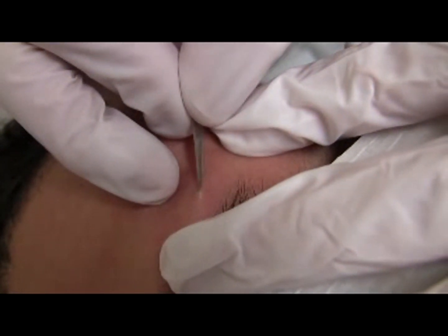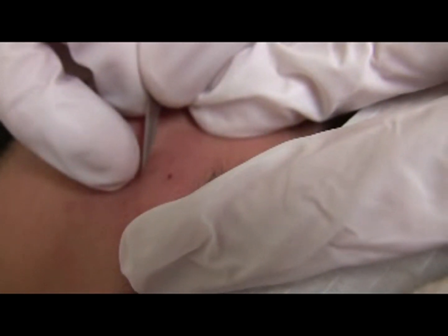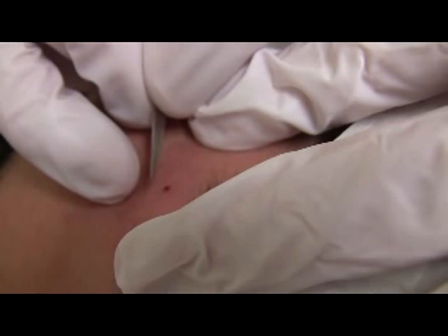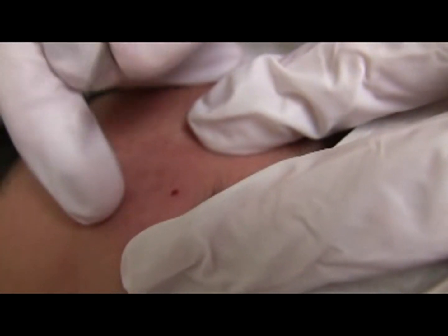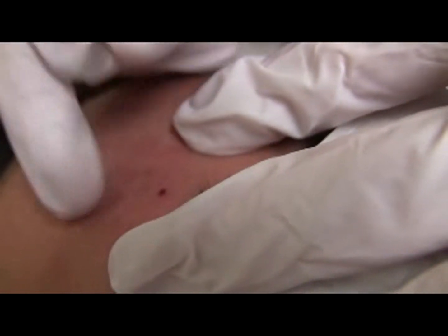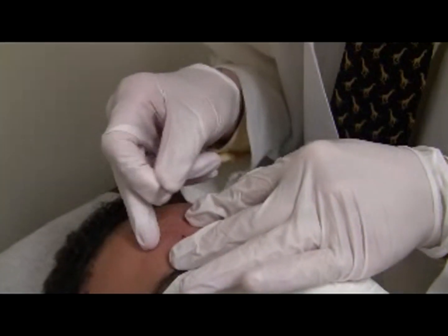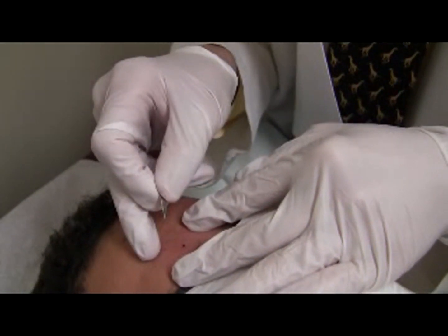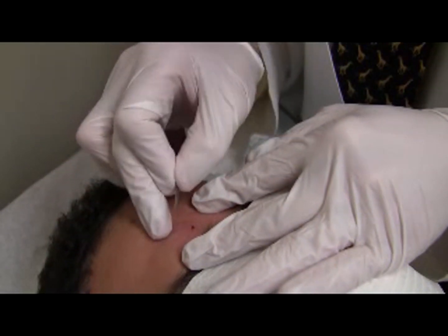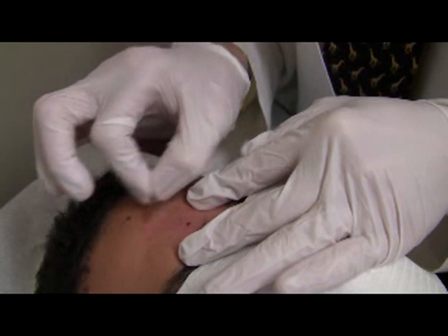I advanced it a little bit and now I'm going to pull upward. Advance the tip of the 11 blade to the center of the lesion. Be sure that your right third finger is touching the patient's skin and that your thumb puts pressure on your right index such that your right index squeezes against your right third finger. The idea is that my finger is the stabilizing point and I'm pushing my thumb towards my third finger so I can give a very controlled, smooth, small motion rather than an uncontrolled movement.